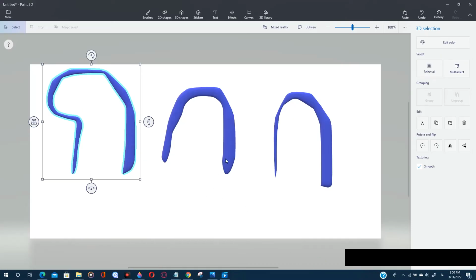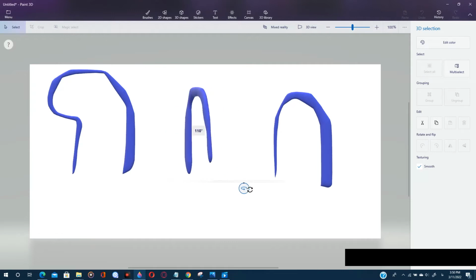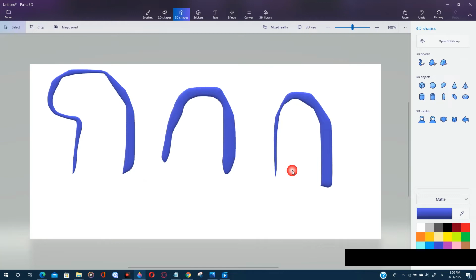So we have the wall that is normal. This wall is normal, the thickness and contraction are normal, and in this image, this is a thinner septum. The septum is thinner due to necrosis of the muscle of the LV.